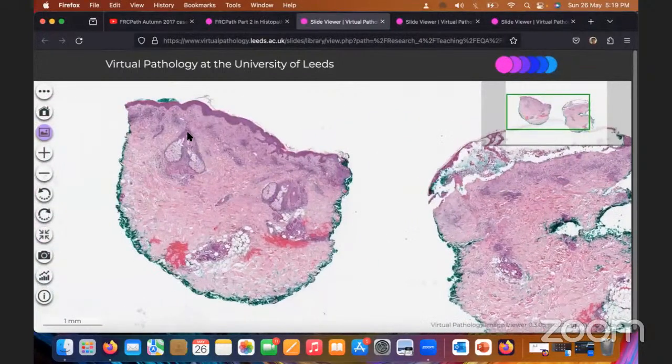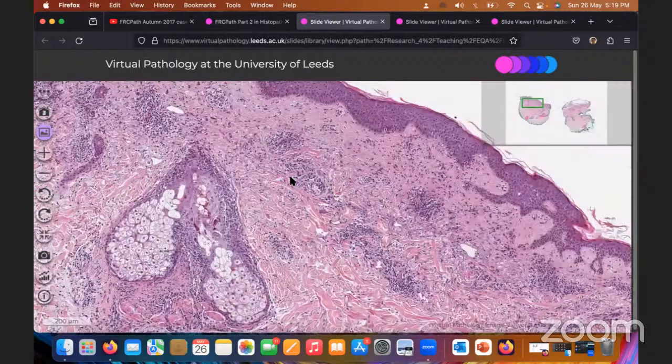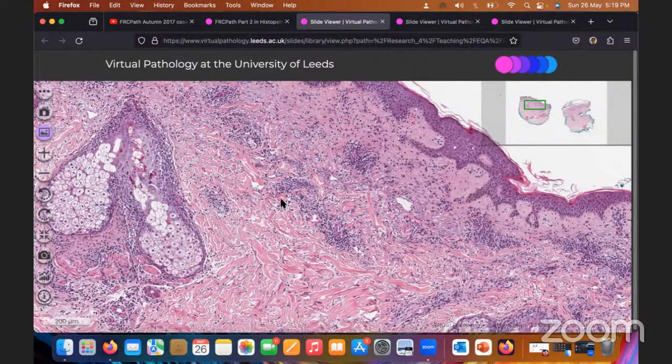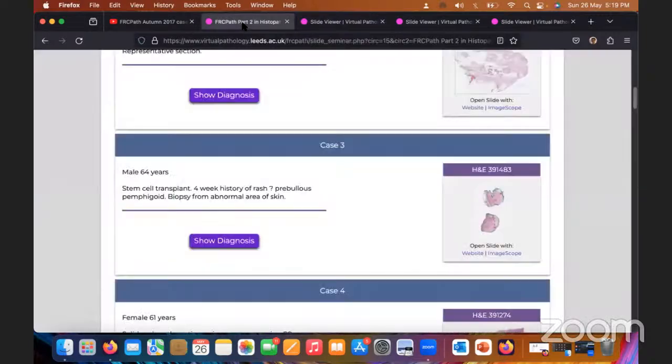So, follicular involvement. How to differentiate it from herpes simplex infection? Herpes simplex will never affect the follicular part, and leukocytoclastic vasculitis will be absent. These two features help to differentiate herpes simplex from herpes zoster. But obviously, the diagnosis is made after PCR as well as after performing immunohistochemistry on the section.